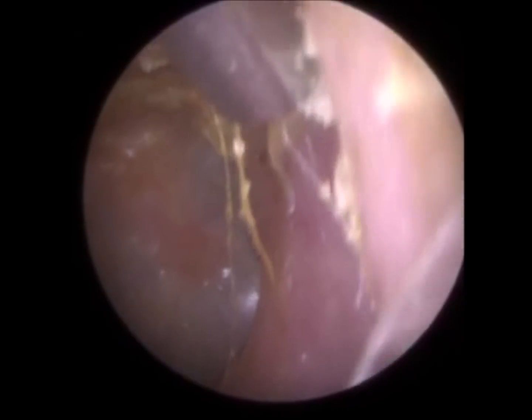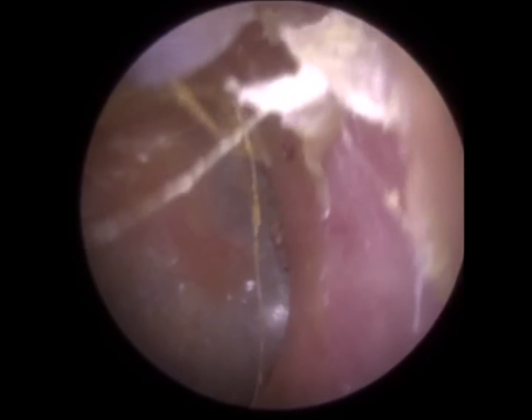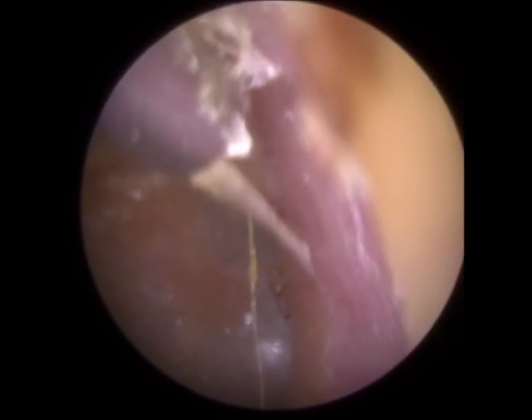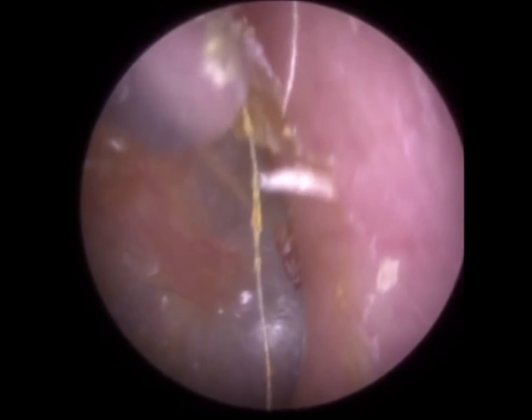With other visualization techniques like microscopes and head loupes, with a microscope at least, you get a fantastic magnification of the ear, but you don't really know which part of the ear canal you're on. If you're looking at the eardrum, obviously you know you're on the eardrum, but even then you don't really see the whole eardrum in one shot. You probably see a quarter of the eardrum.